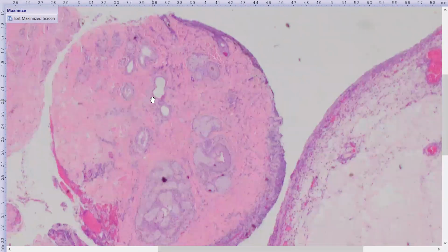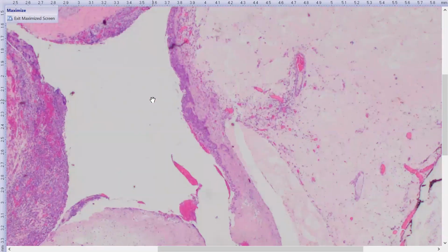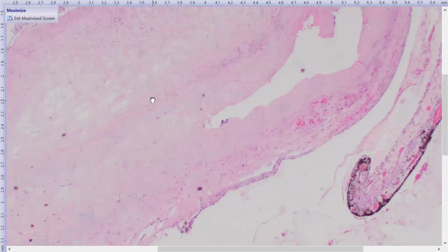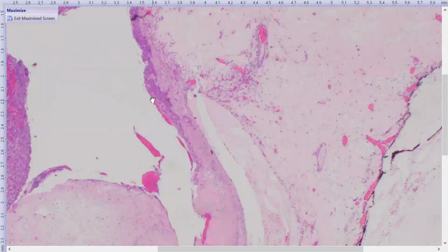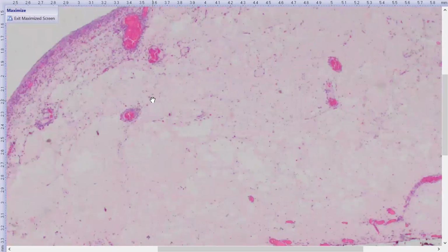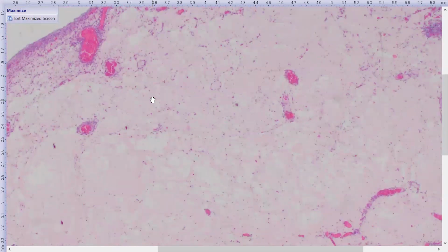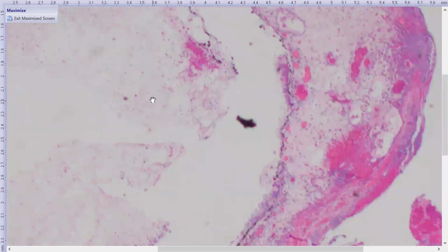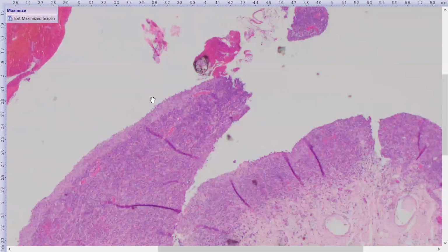Let's orient ourselves as much as we possibly can. As far back as I can go, I think. Yes, it is. So this is that edge that we saw, and then you follow this tissue that was bulging forward. And again, this was that sort of gelatinous tan looking tissue that was forming that curve. And then we have that gap, right?